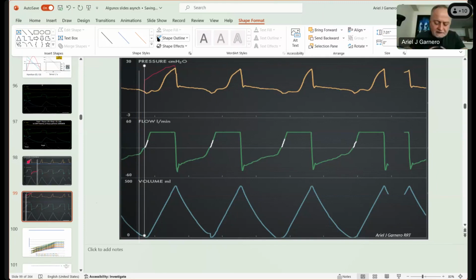Yeah, like you very well pointed out, depending on the mechanical ventilation goals, the first approach would be to liberate the flow by switching to a pressure control mode. Right. And the second approach would be to liberate the I time by switching to a mode that can have a variable I time. And if at the same time you want to serve the goal of safety, you can use a mode like auto mode, volume control to volume support, or auto mode, pressure control to pressure support, so you can serve the goal of safety and comfort.